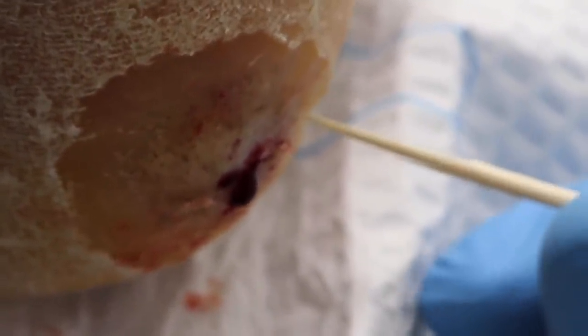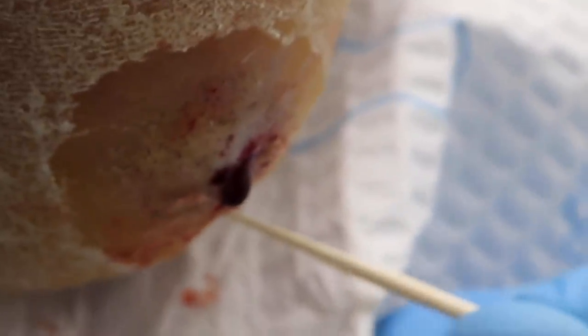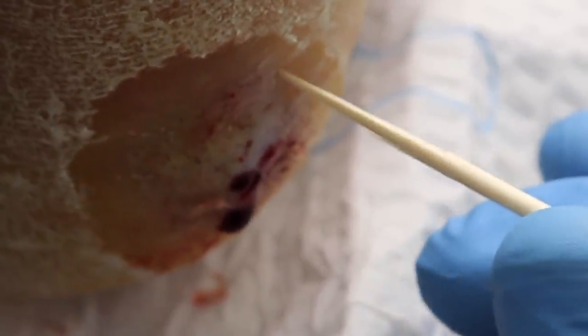It looks much better already. So we're gonna do a little test again. Anything sharp here? No. No. No. Up here? No. Very sharp or just more pressure? You feel this? Yeah. You feel the same up here? No, it's not the same. And here? No, I can't really feel it. Pretty good.